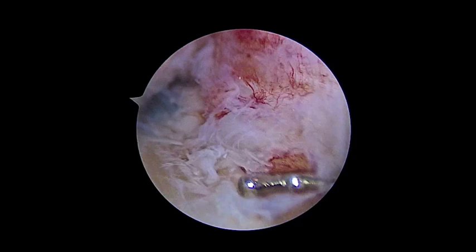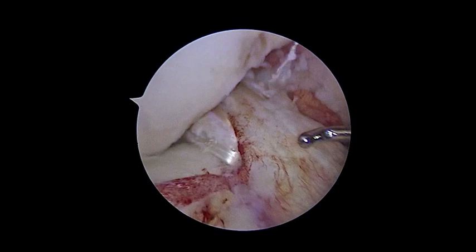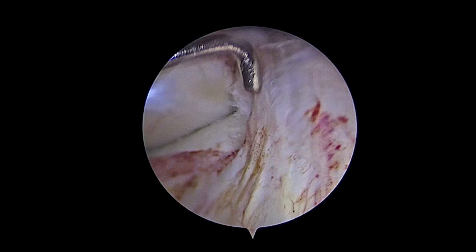We see the excellent tension of the remnant. There is no impingement, and the remnant has its vascular supply intact and regains its tension. In the other view, you see the graft fixed in the tibia and the remnant with the vessels and with the correct tension.